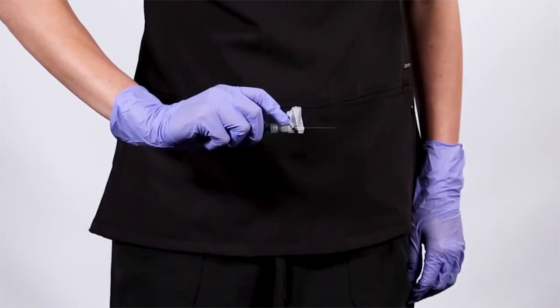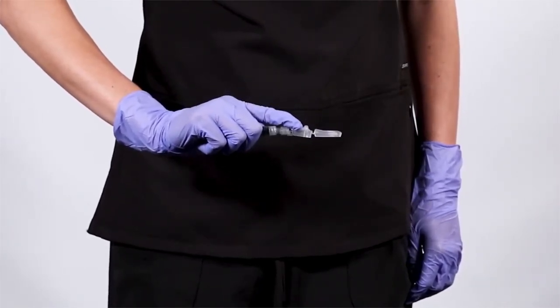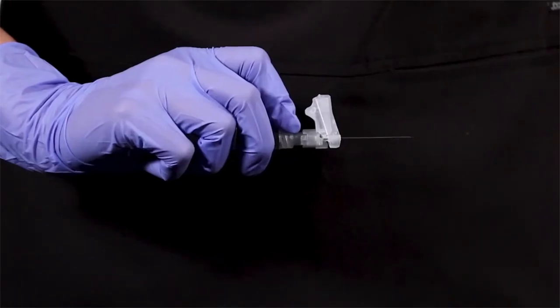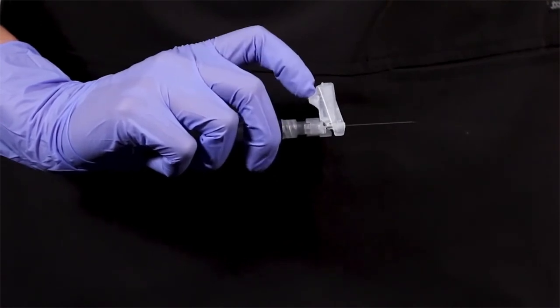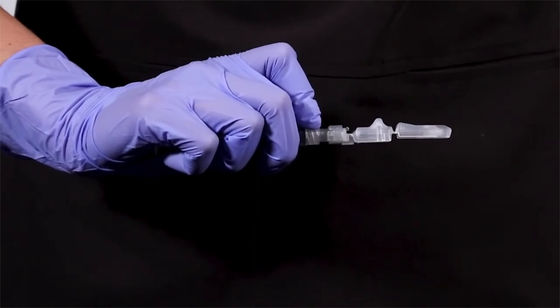To activate using your finger, gently push forward on the safety device. Your finger remains behind the needle at all times. An audible and tactile click will verify that the safety device has been activated to a locked position.